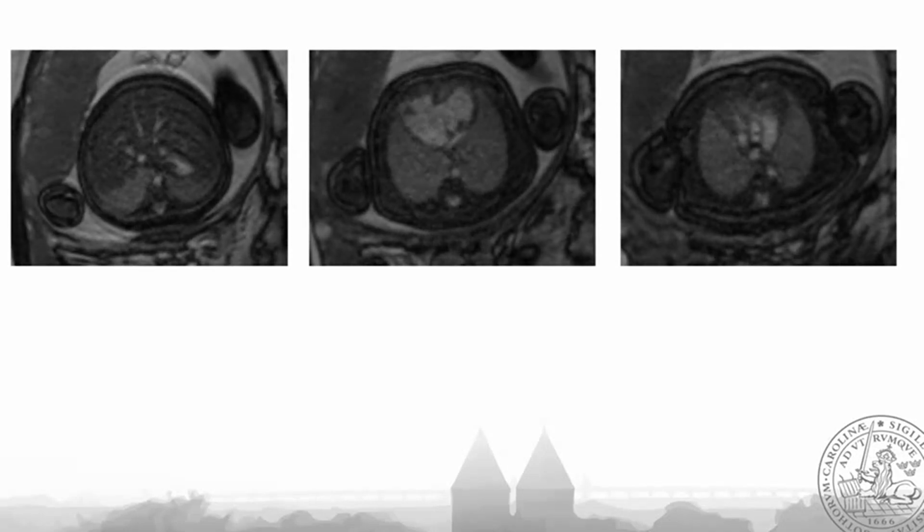Overall, outside of the heart though, we have normal lungs, no lymphangiectasia. We did not see any spleen, so we also had other signs of heterotaxy. And all that information was then available before birth to prepare the parents to be.